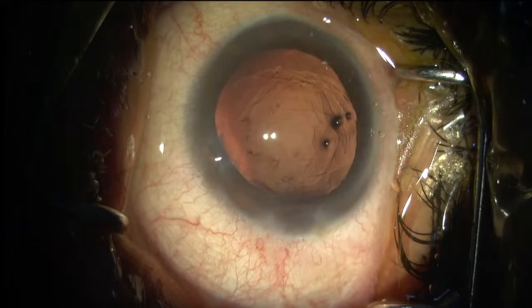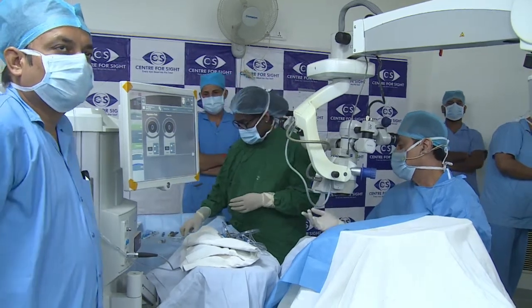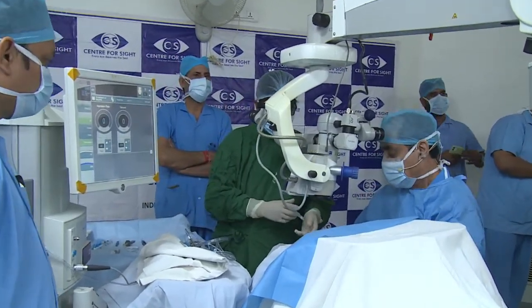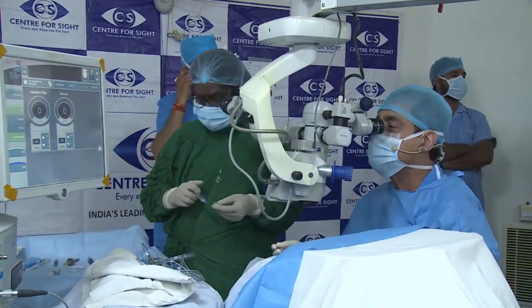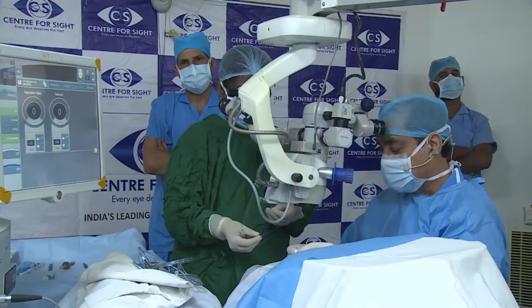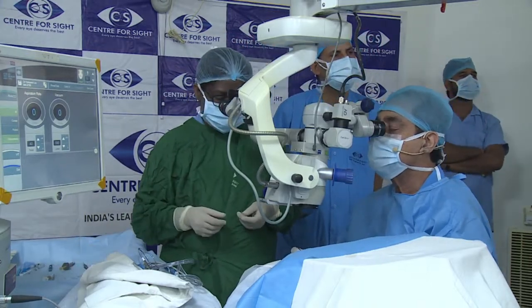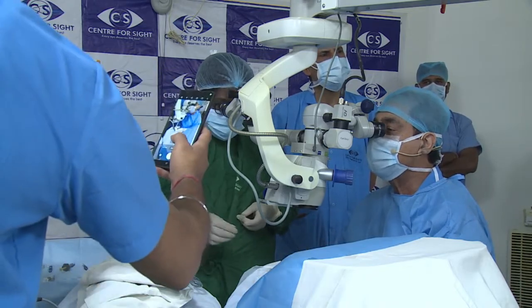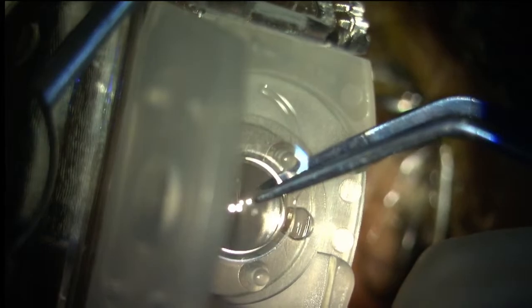Now I'm going to use the IHANS lens system. This is one of the best innovations we have, in the sense that we always wanted the patients to have some intermediate vision so that the ladies can work in the kitchen, can do the makeup, men can shave, and they can walk comfortably. So if you have got a 0.5, 0.75 addition, then even if a patient is emmetropic, around 1 meter, 2 meter distance, he can see reasonably very well.